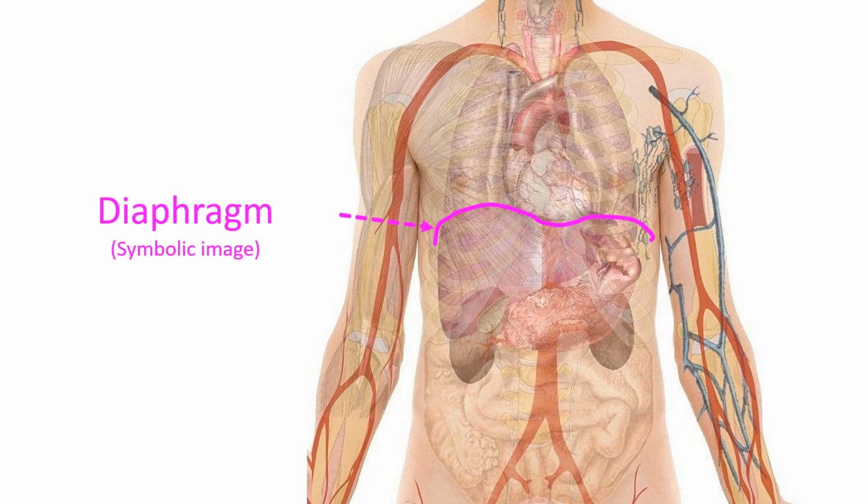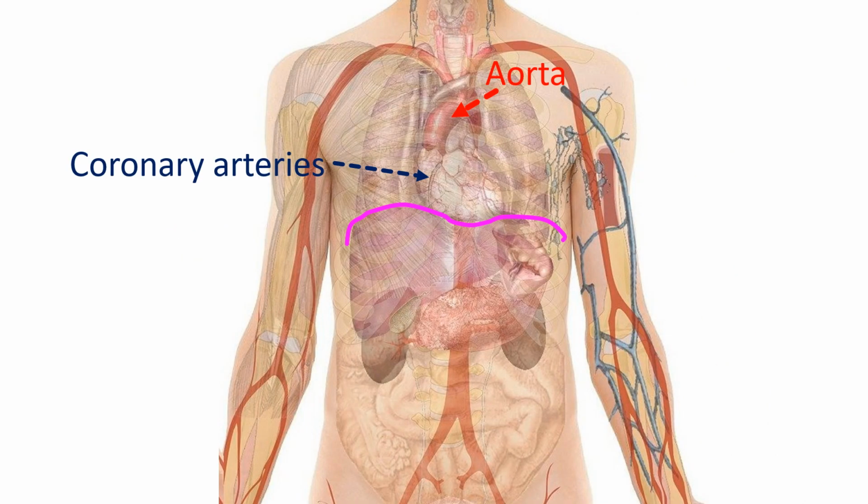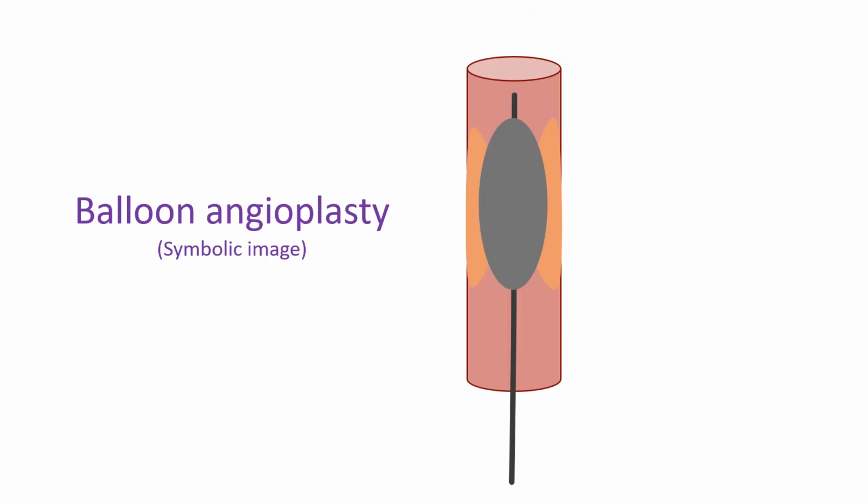Carbon dioxide angiography should not be used for cerebral angiography, and injections should be below the level of the diaphragm. That would mean that carbon dioxide angiography cannot be used in the upper part of aorta or for coronary angiography. Carbon dioxide angiography has also been used to guide angioplasty procedures in abdomen and in the legs.